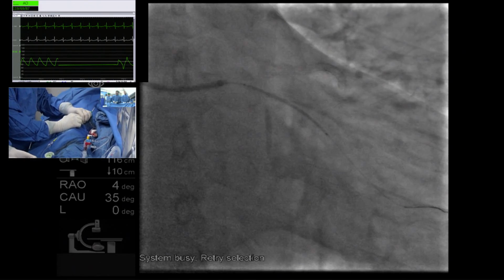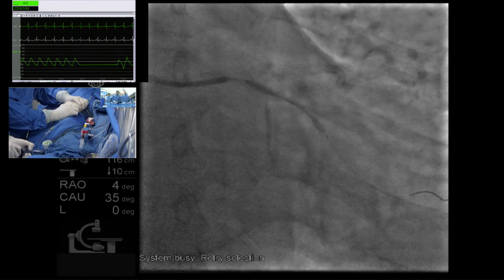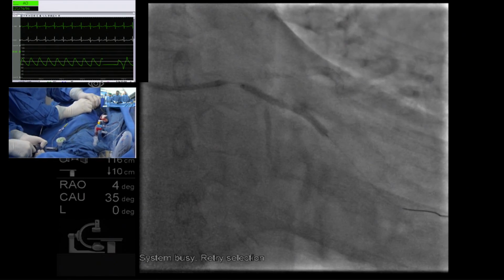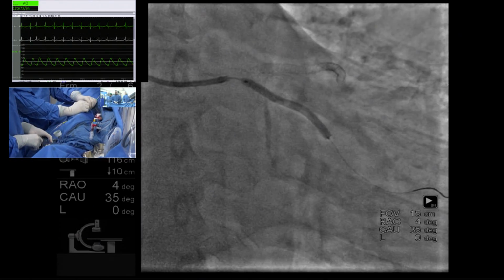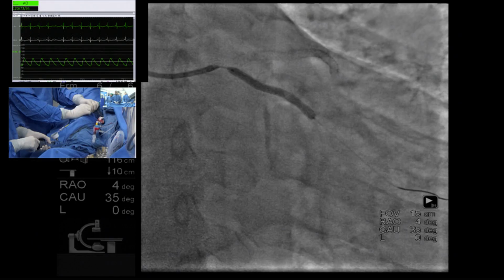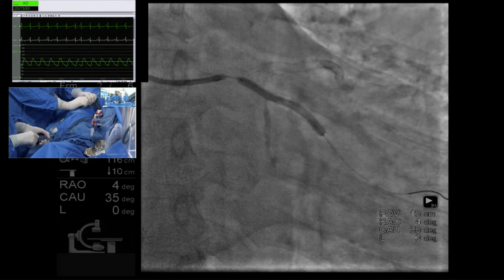Let's go up to like 14. 8, 10. Yeah, look at the size there. Look at the size. 14, clearly. I have to admit, when in Rome, you do like Romans. When in India, you do like Indians.